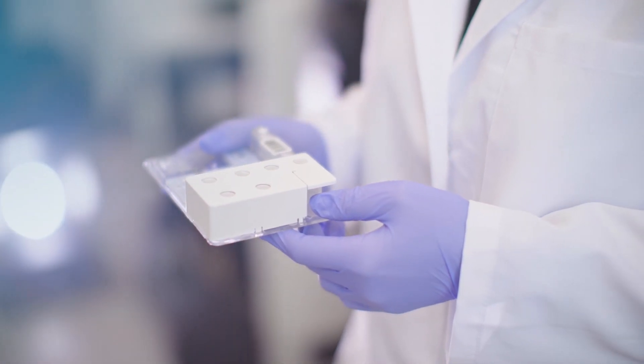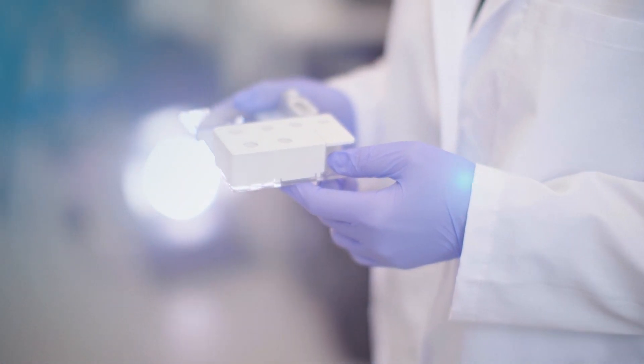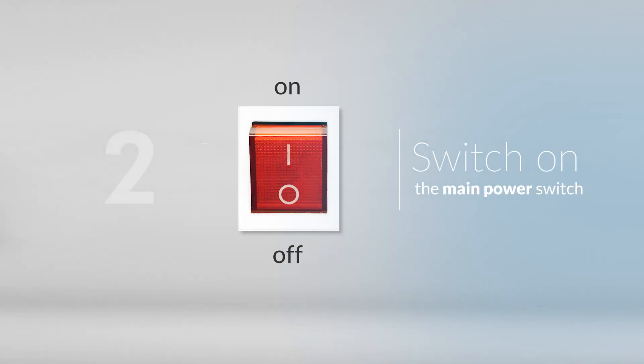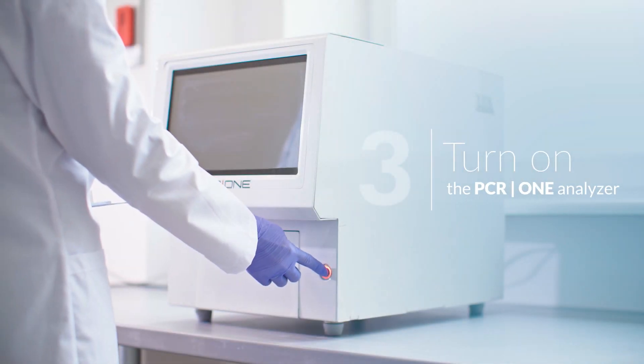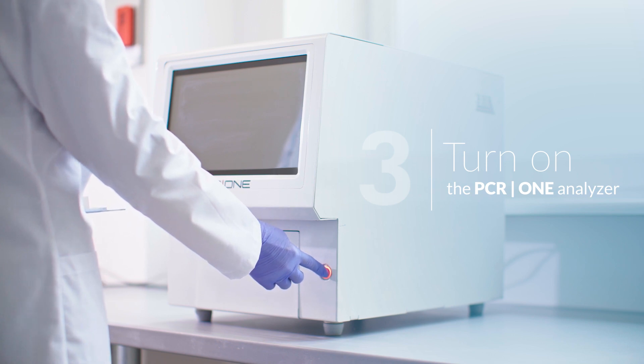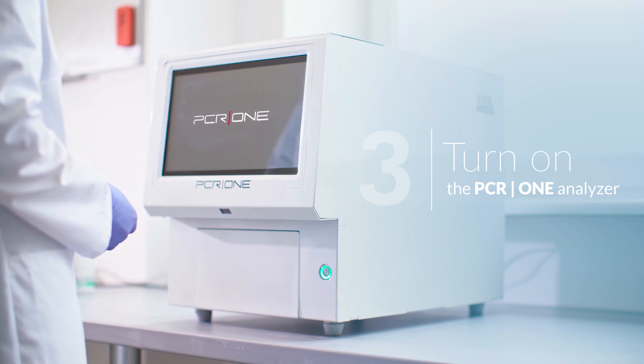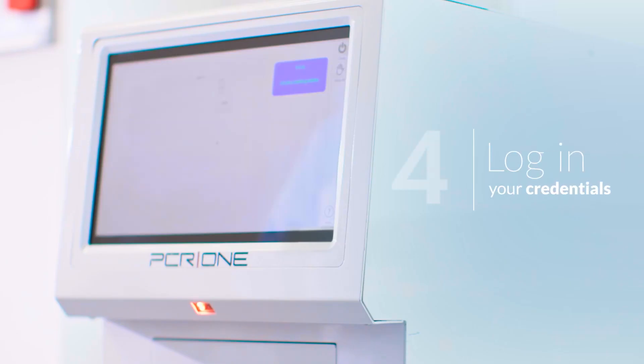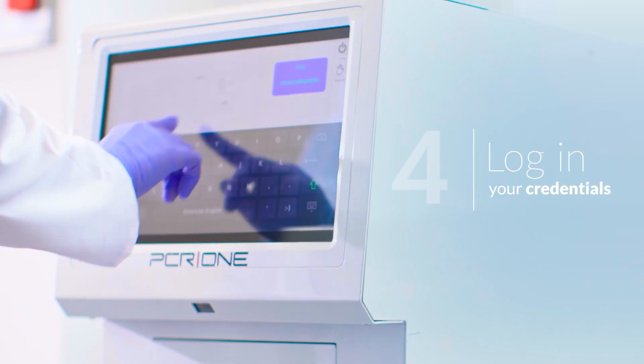If you launch the PCR1 analyzer for the first time, follow this procedure. 1. Make sure that the PCR1 analyzer is connected to the power supply. 2. Switch on the main power switch located at the back of the instrument. The switch should be in the on position. 3. Turn on the PCR1 analyzer using the switch at the front of the instrument. The button light will change from red to green and the login screen will appear. 4. Log in using your credentials.